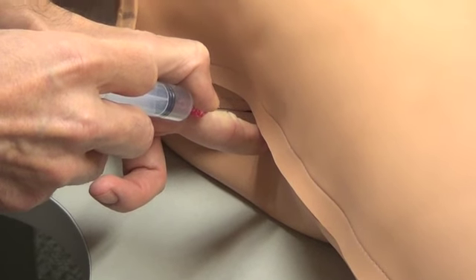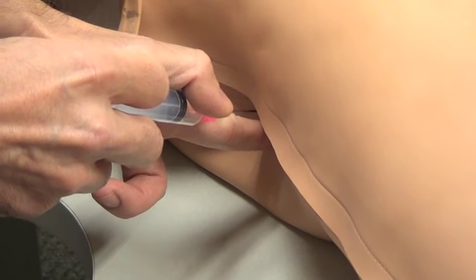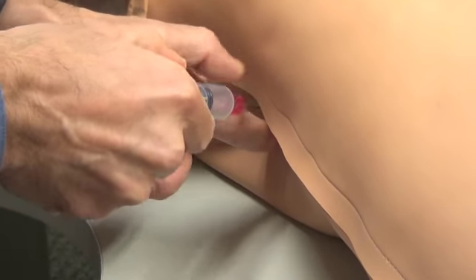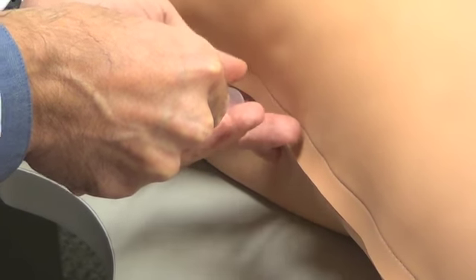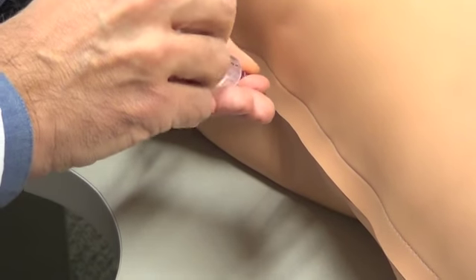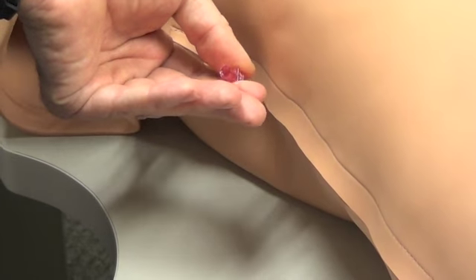Of course, we will have numbed up this area if this were a regular patient. I now have access to the pleural space. My angle of attack is such that when I feed the wire — as you'll see me do next — the wire will actually enter the pleural space and proceed in a posterior cephalad manner.